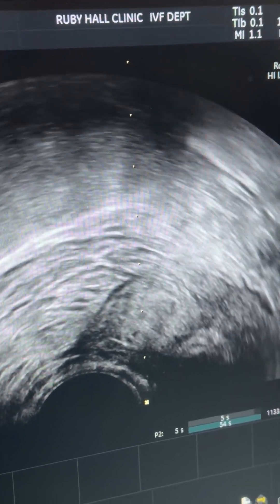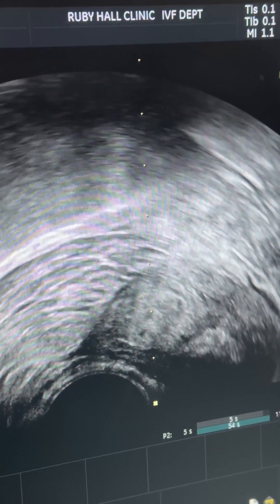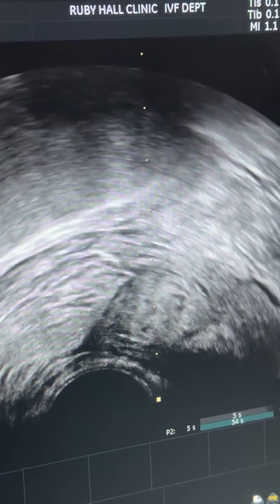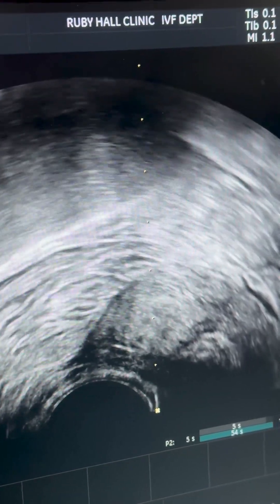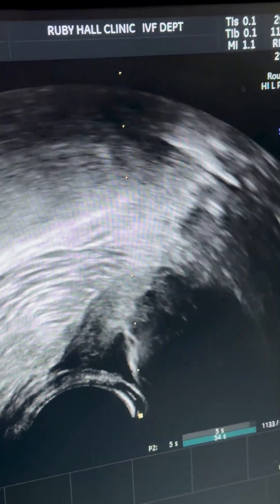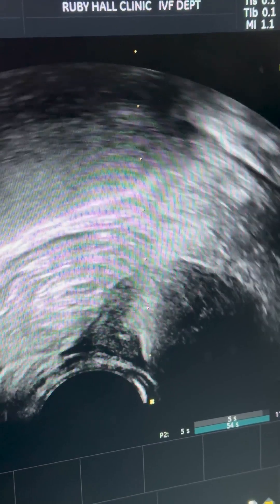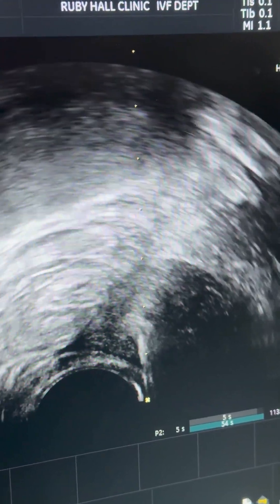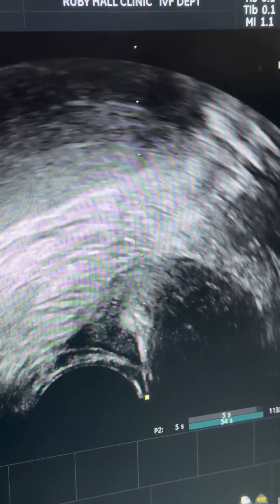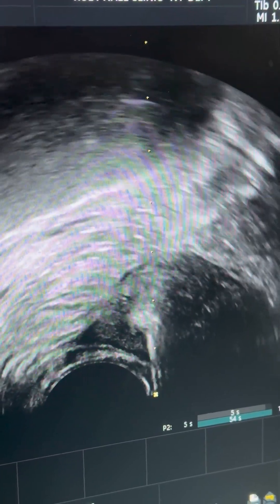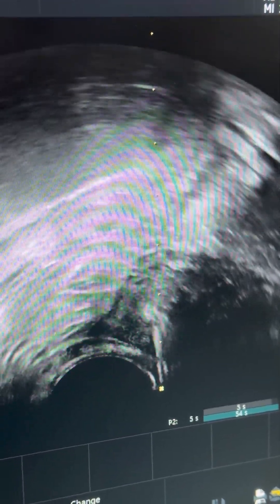Titrate up to the needle, then go — watch it. I will be titrating there. Push it. Now I am going again to the same side. You can see I am there and now she is pushing. Just half CC first — push half CC. Can you see my needle there? In the side — push it. Another half CC. And that's it. I am not going to increase the pressure here.